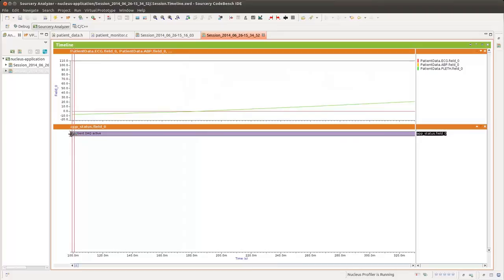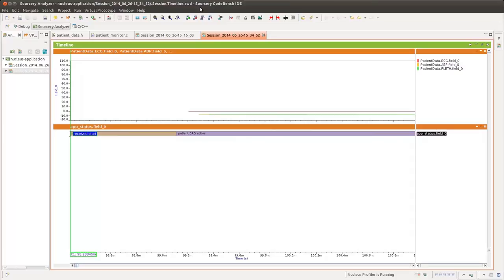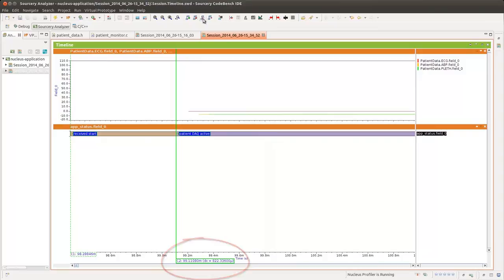Zooming in on the beginning of this graph, we can see how long it took from the time we received a start message to the time the data acquisition went active. It is at this point that we see the patient data variables in the first waveform begin to hold values.